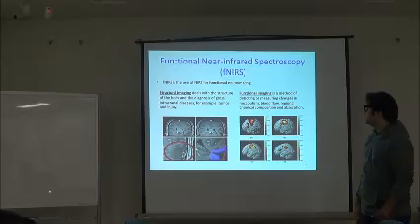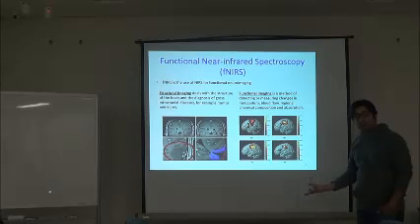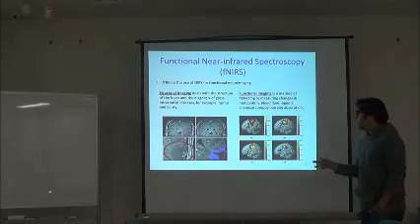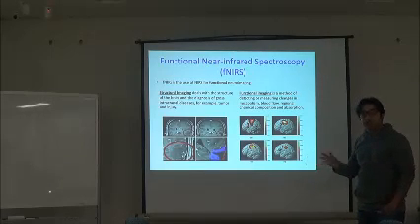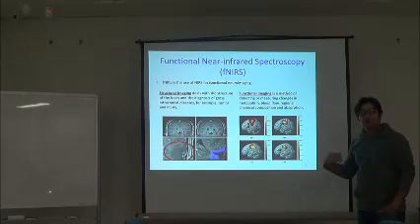Functional imaging deals with detecting or measuring changes in metabolism, blood flow, or chemical composition in the blood, due to the response to some event or activity.